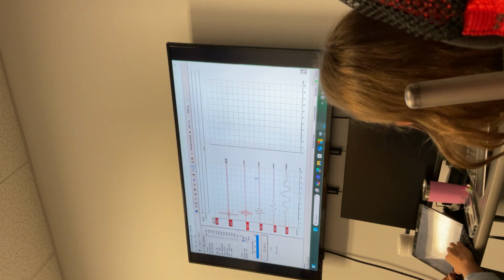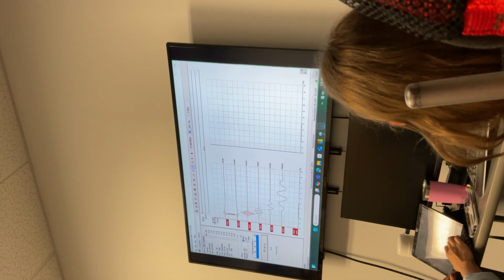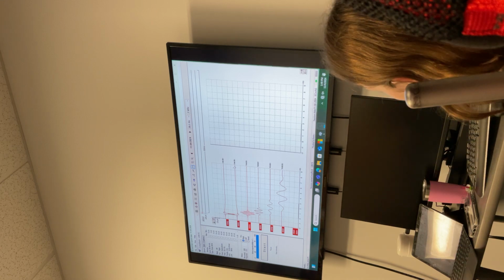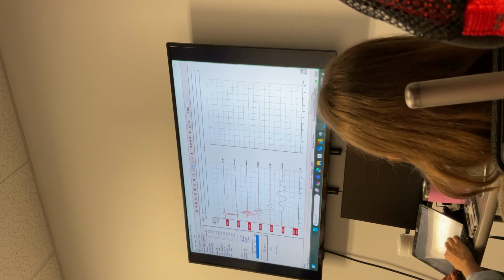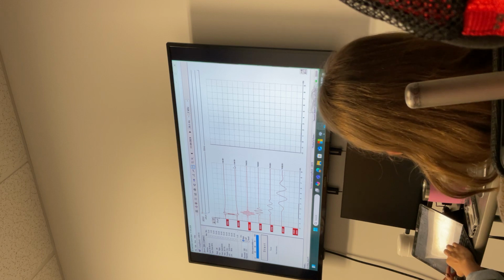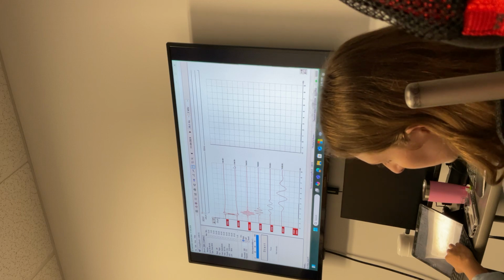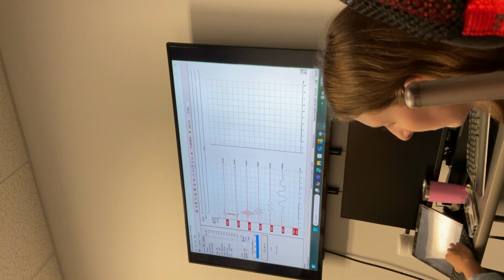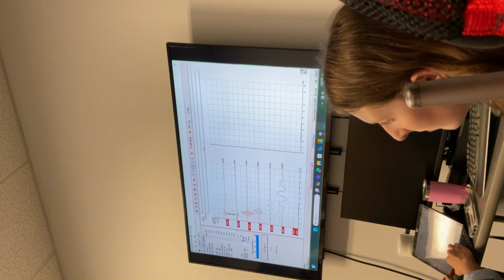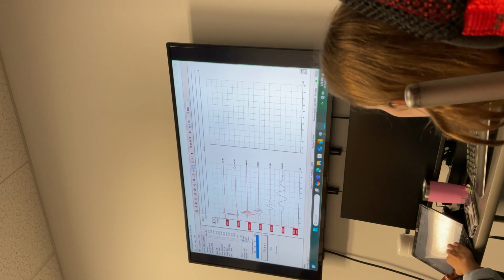Okay, how do I come back to that? Another point I want to make here is that 0 denotes the onset of the sound. On the time waveform, 0 is where the sound is being played through the insert, through that foam. That is 0. So when you're playing clicks and tone bursts, 0 on the x-axis denotes the onset of the sound being played to the ear.